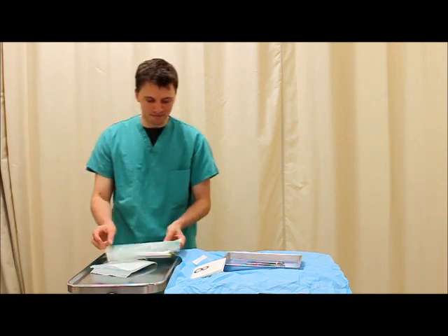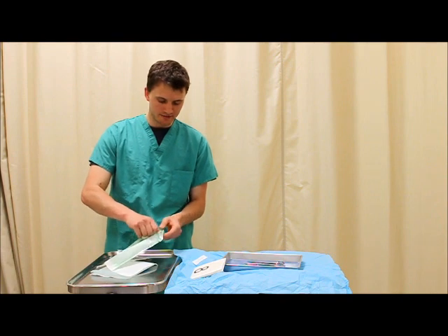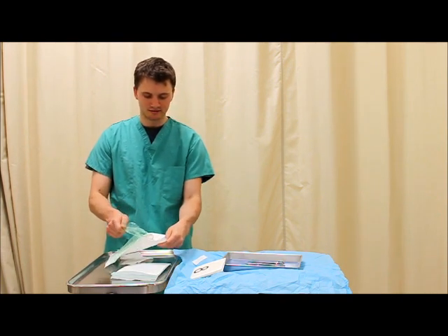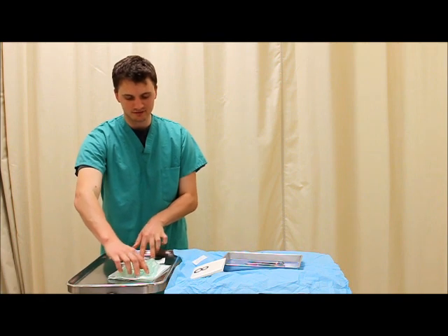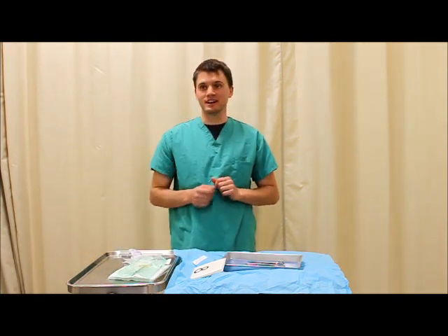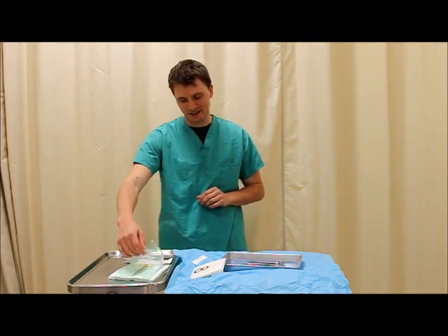And last step, we're going to move some forceps over. And this one we're opening up in the same manner, but we're actually going to leave it off the sterile tray with the forceps towards you. And so these can actually be grabbed and used during surgery or whenever, and it will stay sterile on the side here. And that is the proper way to set up a sterile tray.